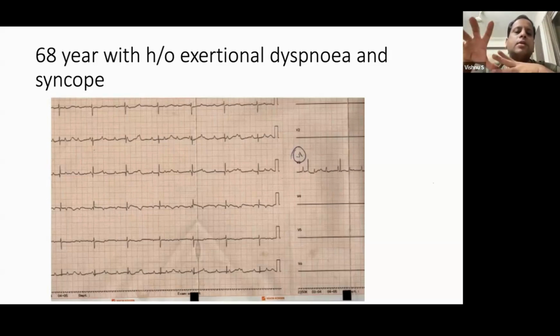So we'll be seeing what things in the ECG will tell you these people are okay. But for complete heart block, there is no medical management. You should tell them about the pacing strategies. That is the treatment of choice. But some of them can be on medical management, and some have very subtle ECG findings, but they need to undergo pacing early because they are at high risk for sudden cardiac death. From here we will be seeing complete heart block ECGs with some of those findings.